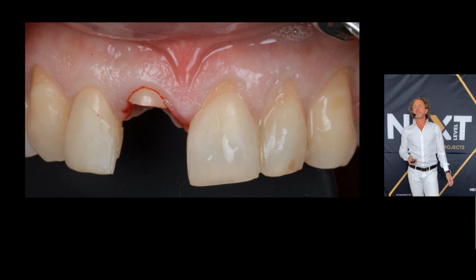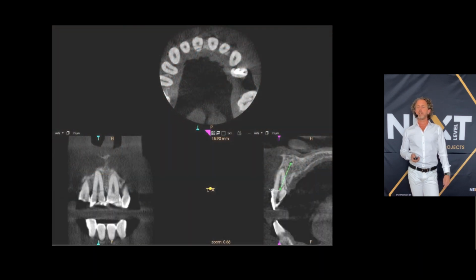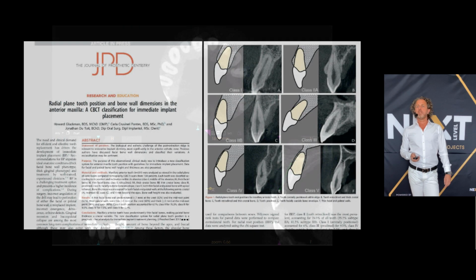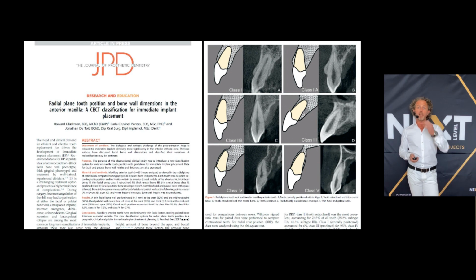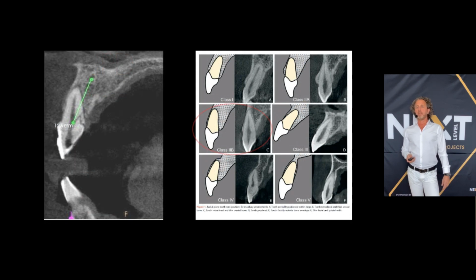It was an accident, and when I removed that broken coronal part of the right central, and I checked on the CBCT image, we realized multiple fracture lines. And from a new study, we have a new classification of the bony profile of the implant site. And now we see that this case belongs to class 2B.